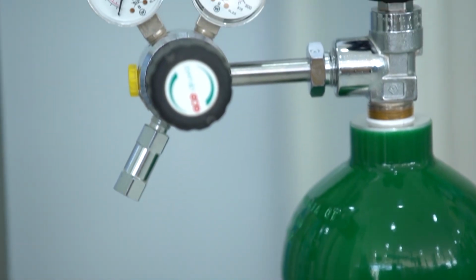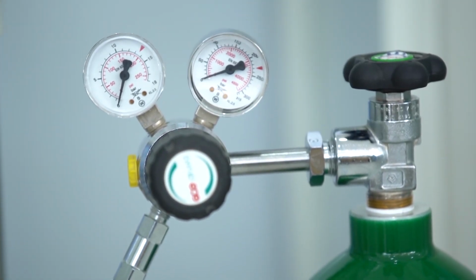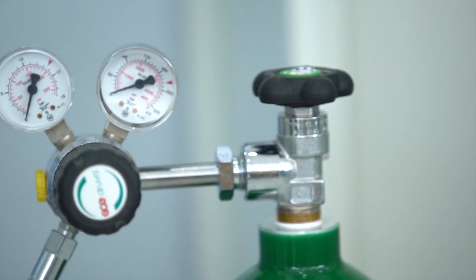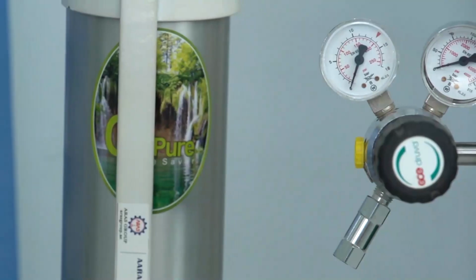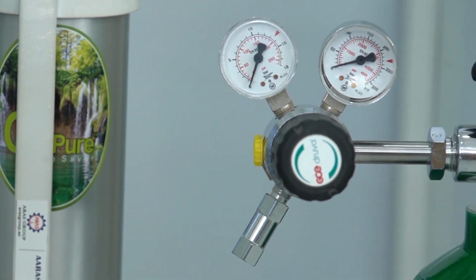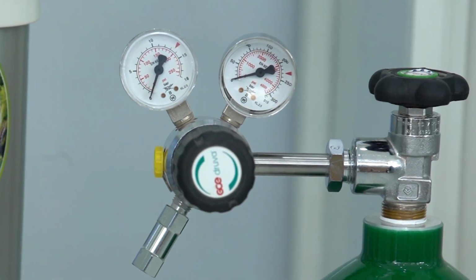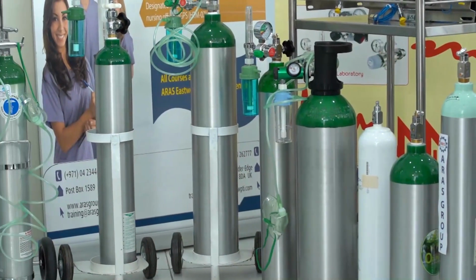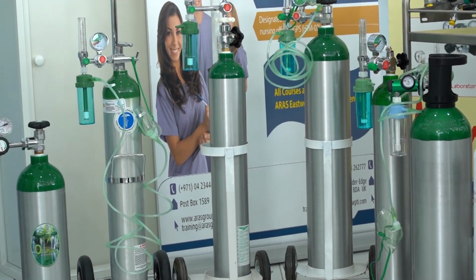The third one is a multi-stage regulator which you can connect to the cylinder. Whatever the cylinder pressure is, you can see it on the regulator. But you have another gauge which shows the pressure and flow we are using on the system or the patient. That's a multi-stage. Again, we have another type of regulators. All these different types of regulators have different purposes and applications.